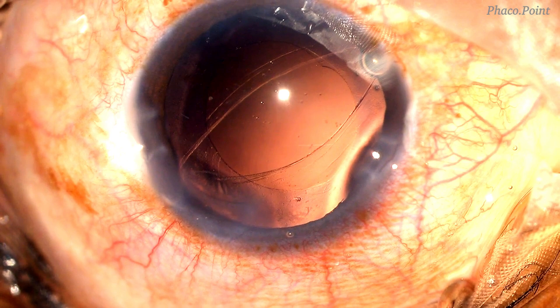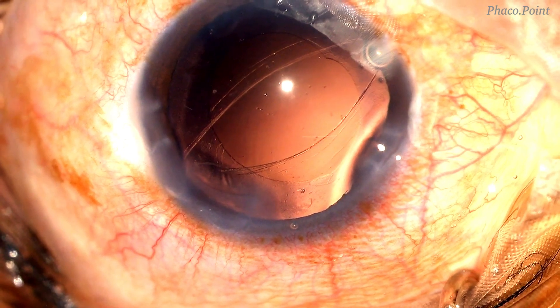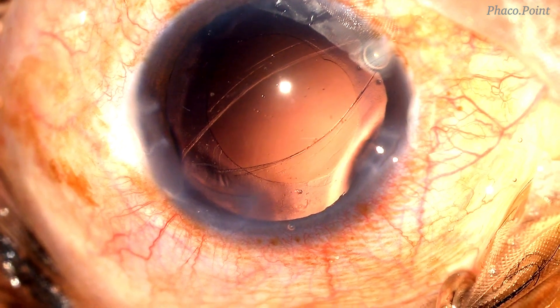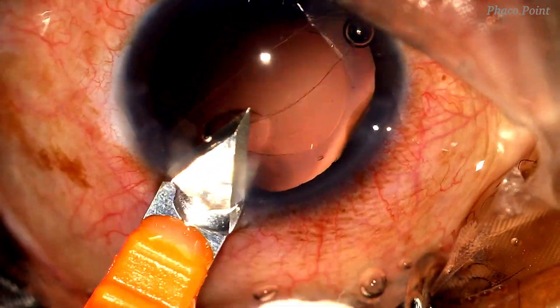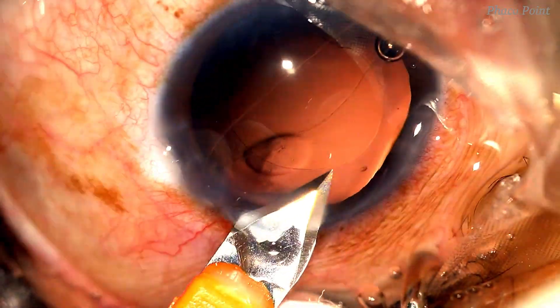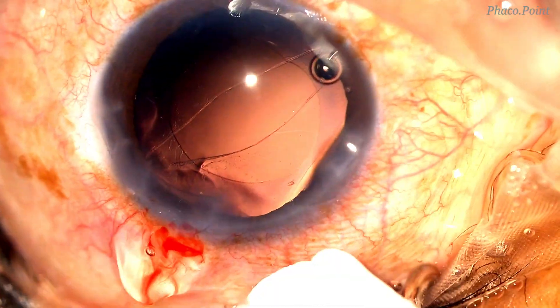Following completion of the nucleus, epinucleus, and cortical wash, we can now see that the tear in the posterior capsule has extended from equator to equator, most likely as a result of the intraocular manipulations. We also note that the anterior chamber is free of vitreous. We now proceed to introduction of a 3-piece IOL in the sulcus, and to enable ease of entry, the 2.8 mm incision is enlarged to a 3.4 mm incision.